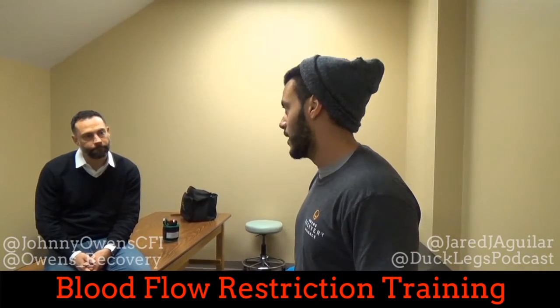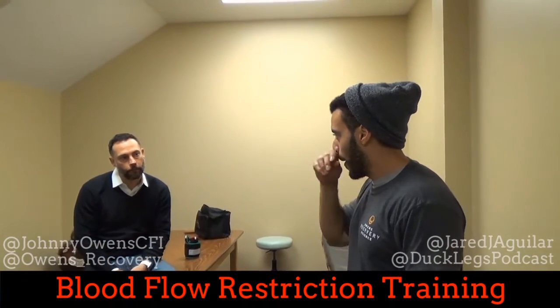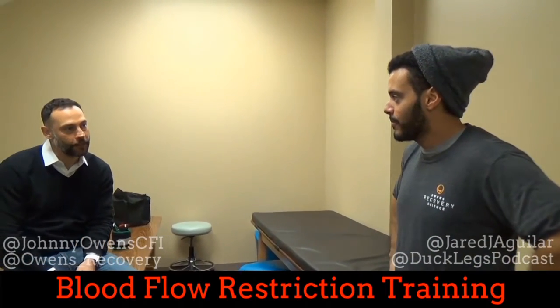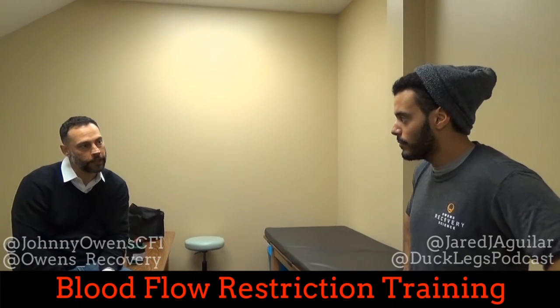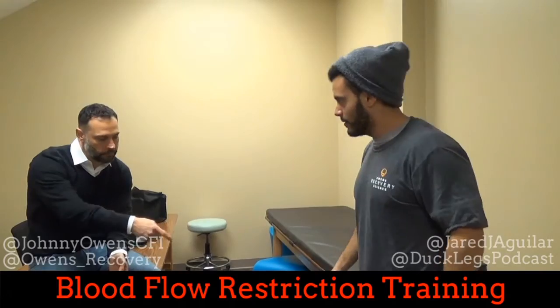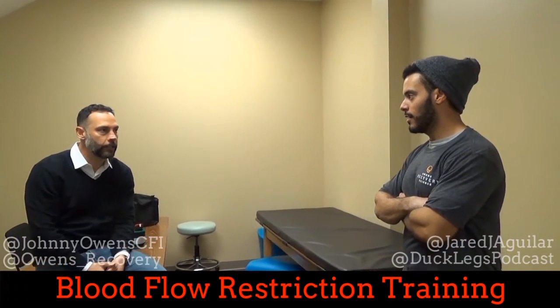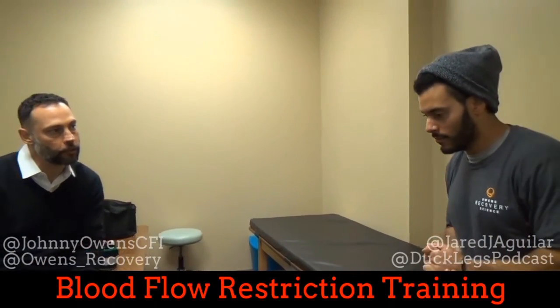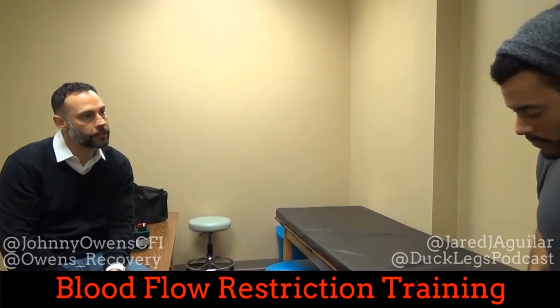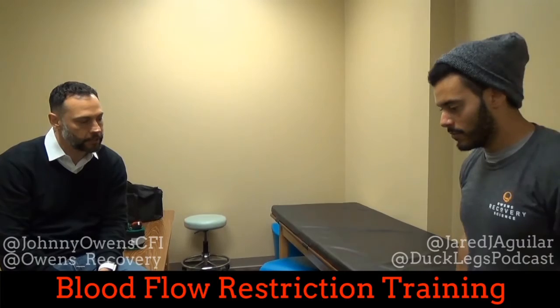I feel better than some regular squat days. It's just super localized. Think about someone after a back surgery who can't put a load on their back — we can do this on the legs and maintain muscle without risking any load on a post-surgical back. All that lactate buildup stimulates endogenous growth hormone release. Growth hormone helps with collagen synthesis, which happens in bone, tendon, and joints. Can therapists manipulate endogenous growth hormone releases to improve healing? And what does the increased stem cell load we see from BFR do for people trying to recover? It's fascinating.